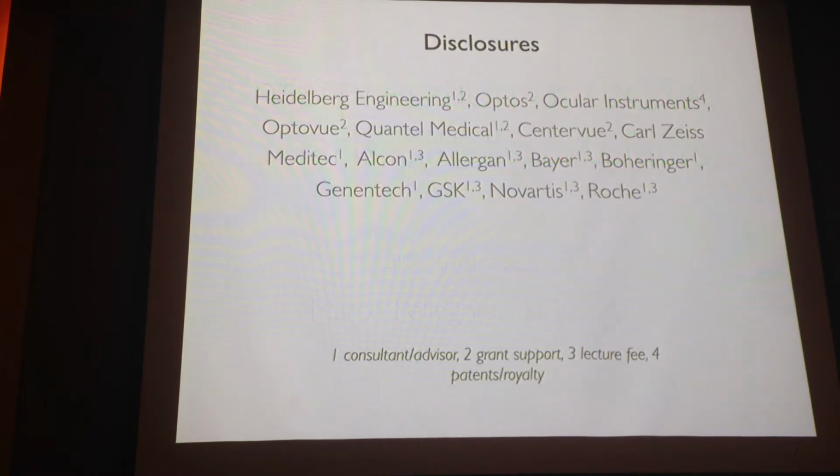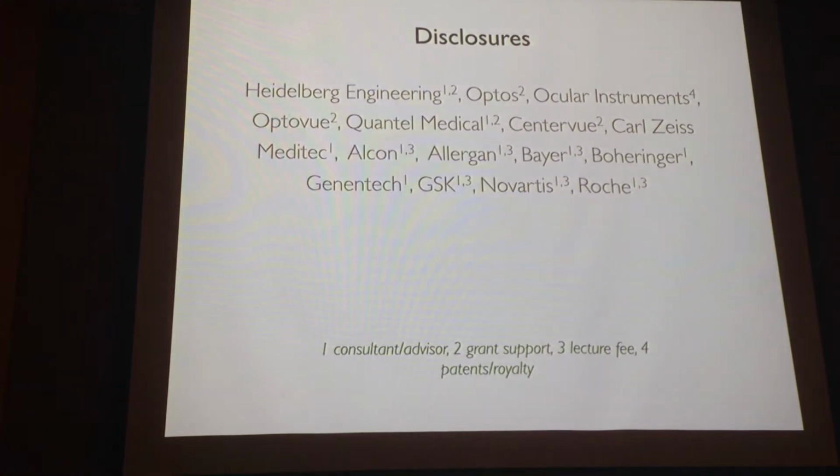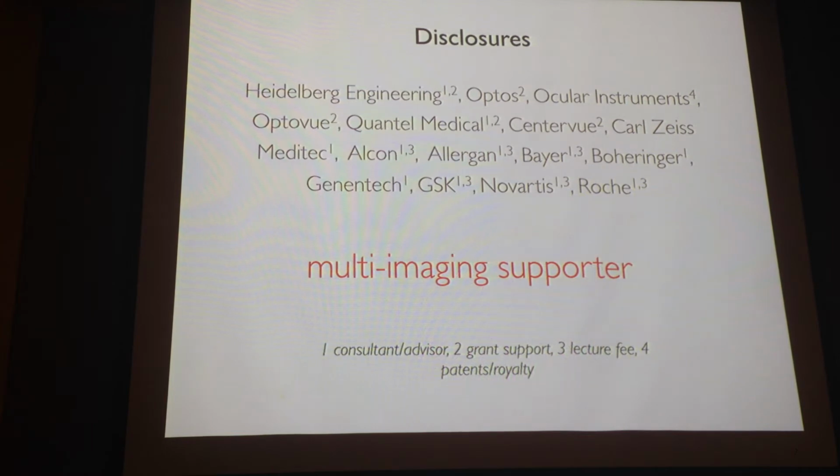First of all, my disclosure: you see that I'm working with many companies on imaging, so you can see different types of instruments here. But I will be a little bit cold in the presentation of angiography, because I think it's a multimodality imaging approach. It's quite important, so it's not just something in the multi-imaging support.